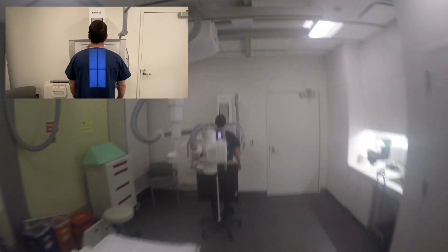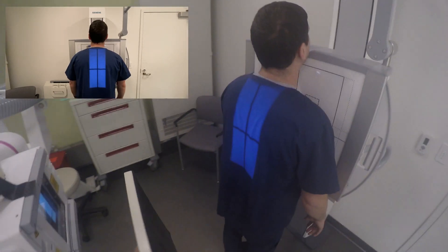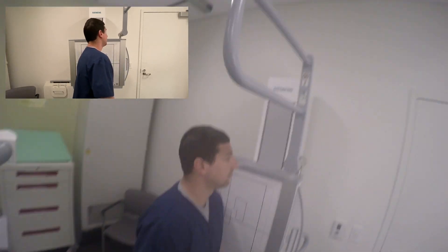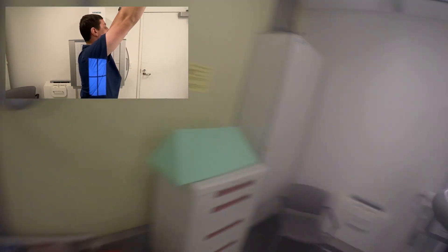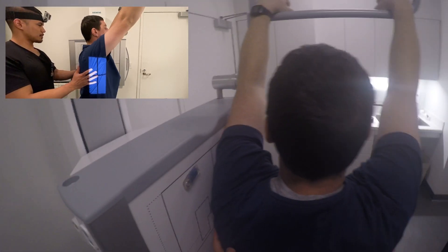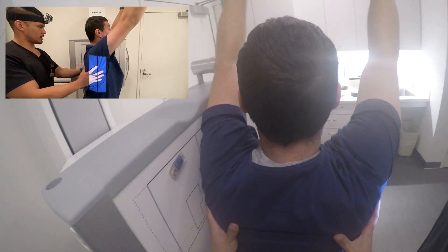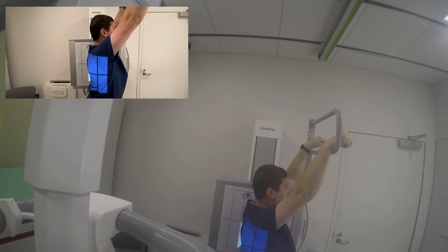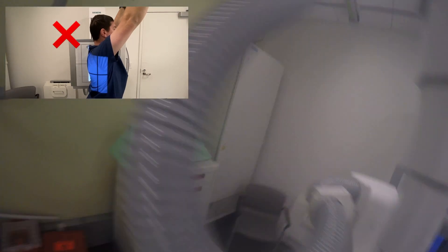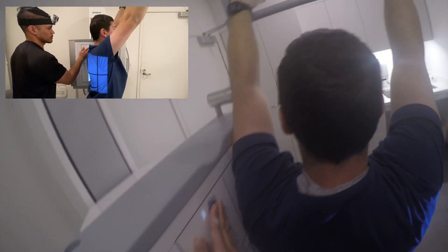I then have my patient turn to their right, left side against the board. Hands on the bar to get their arms out of the way. Have them move left until they touch the board to decrease OID and to encourage no movement. Move them forward or backwards to have the T-spine in the center of the central ray. Also have them move their feet when they move so they're not leaning, to keep their spine vertical. Remember, even though the shoulders and arms move, the spine does not. So leave the tube and bucky aligned where it is. Looking back at this example, I should have kept my collimation how it was and just moved him forward a bit instead of opening up the collimation. Had I taken the exposure, I would have had the area of interest, however with unnecessary tissue exposure anteriorly of the T-spine.